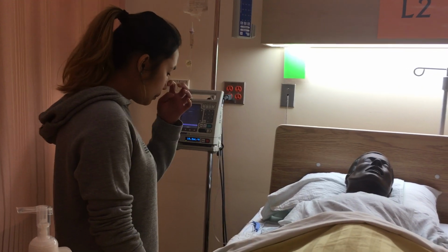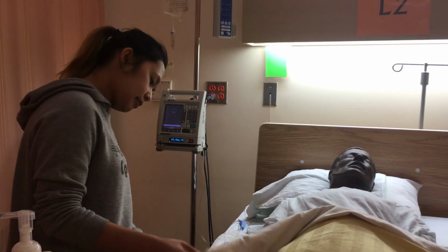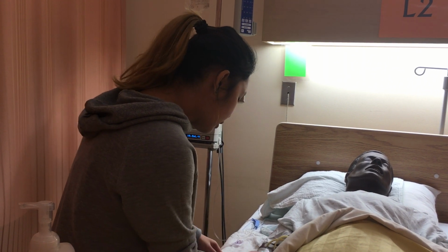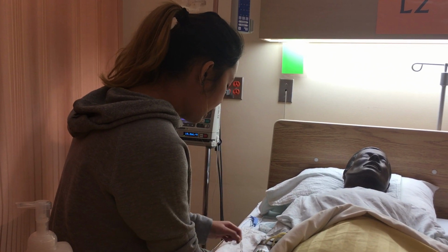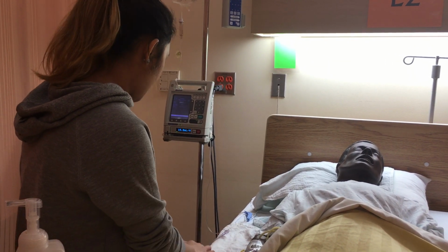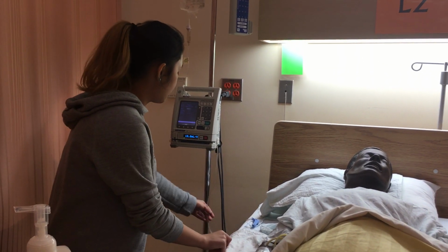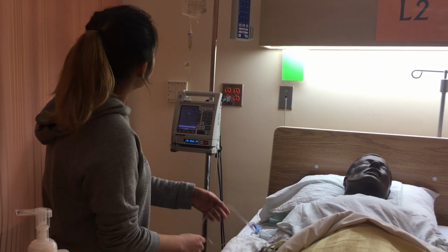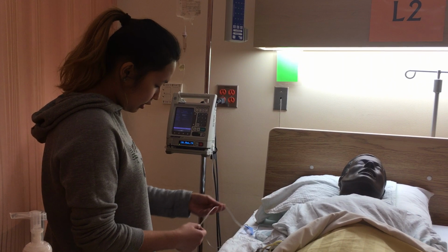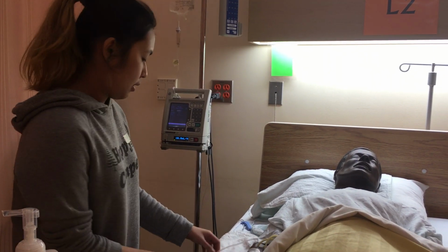I'm also, before I administer, I'm going to check your IV site, make sure that it is okay and that there is no pain, no redness or swelling. I'm also going to check the currently infusing line, make sure that it is running and there are no occlusions, no kinks, to ensure that everything is going smoothly.